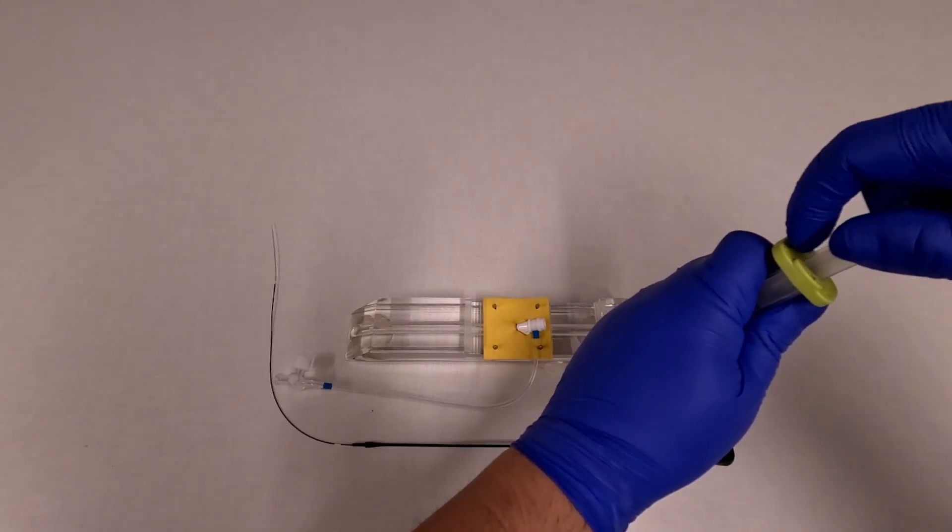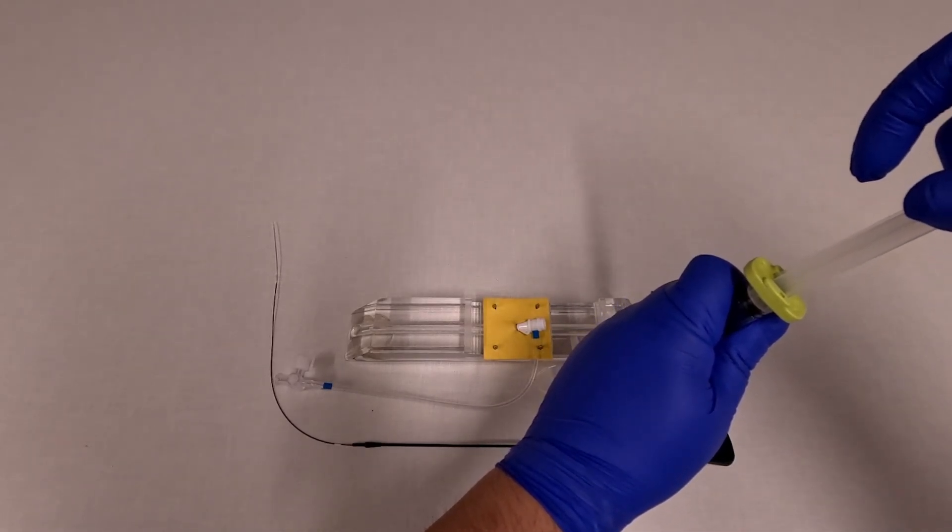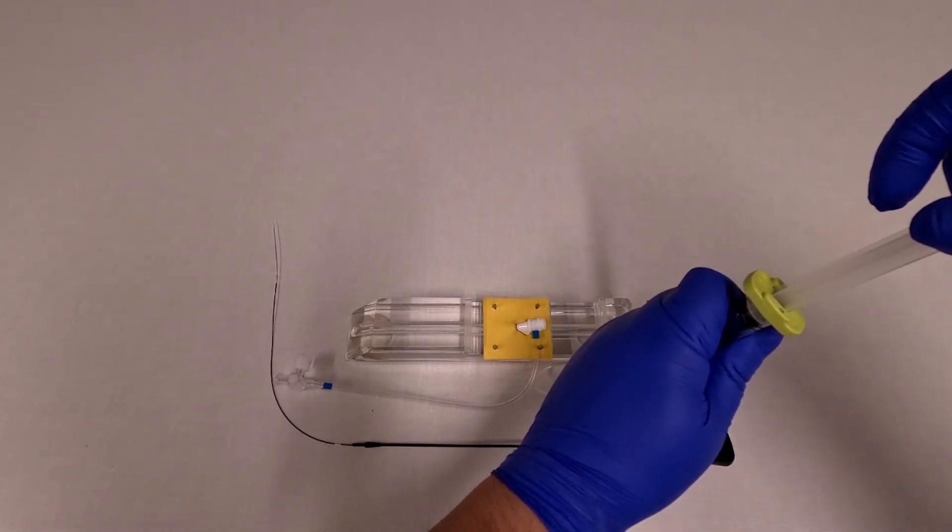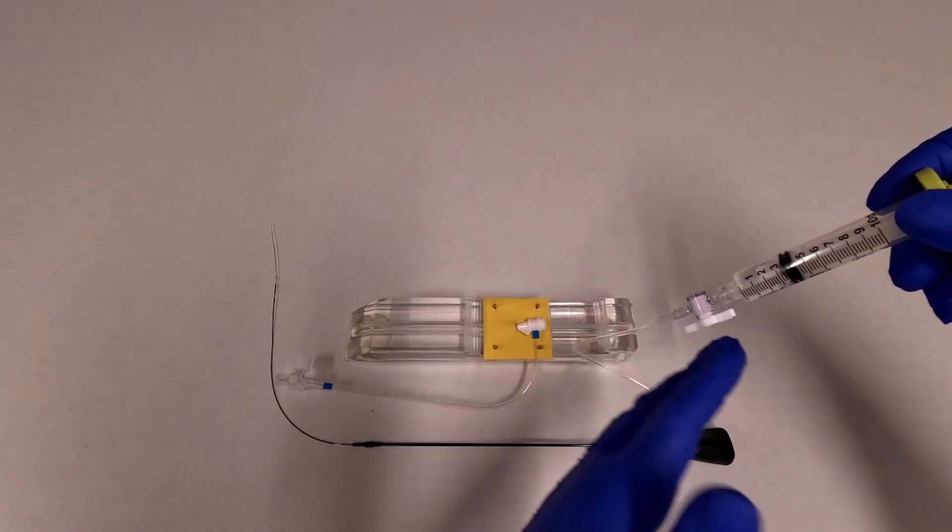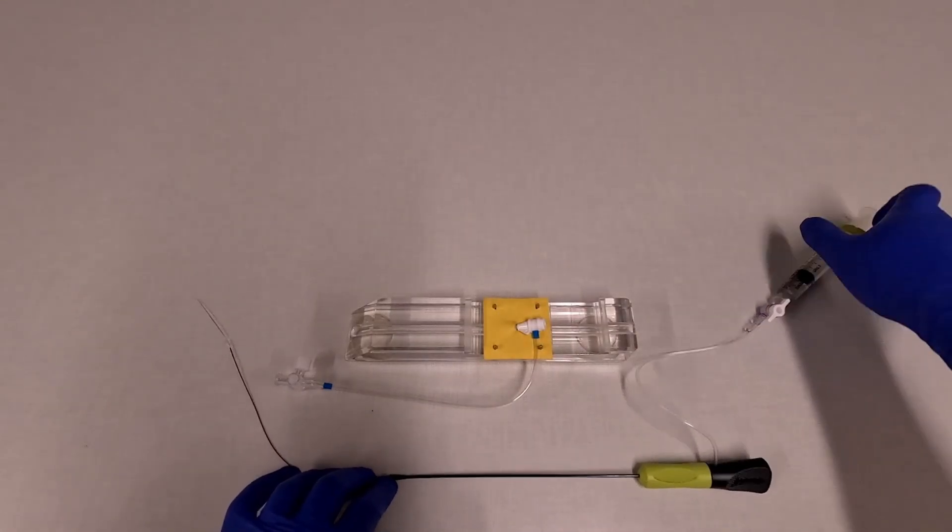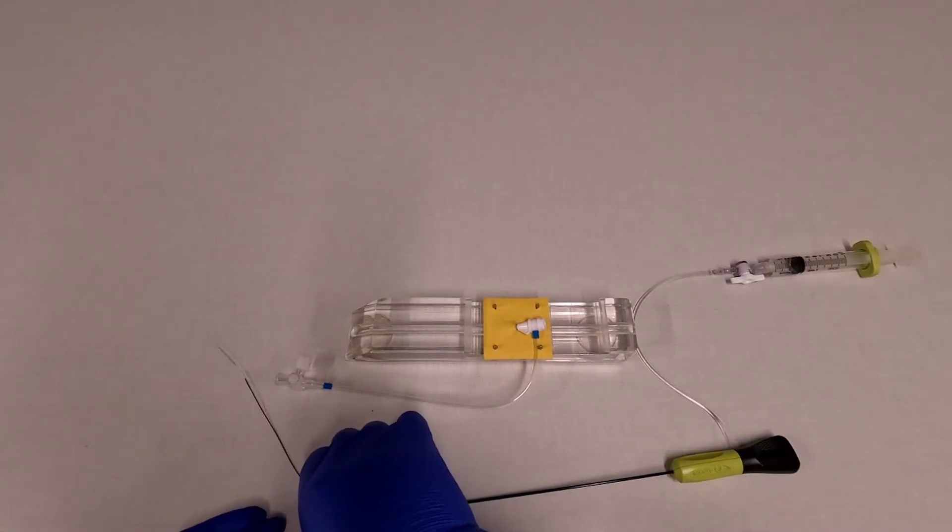Then we just pull back on the syringe to make sure that the balloon is collapsed. You don't need to lock it. You can just leave the syringe in its neutral position. Now the device is ready to deploy.